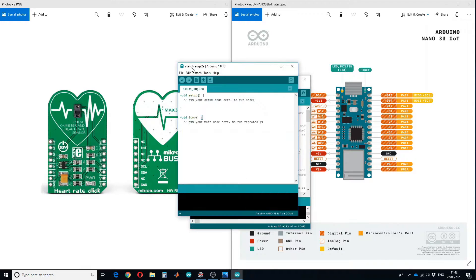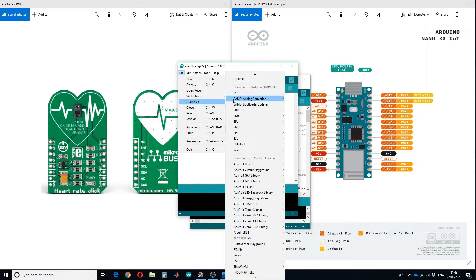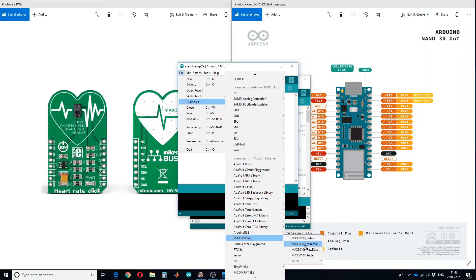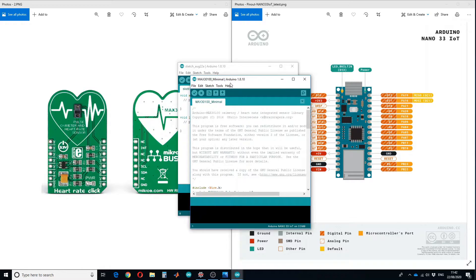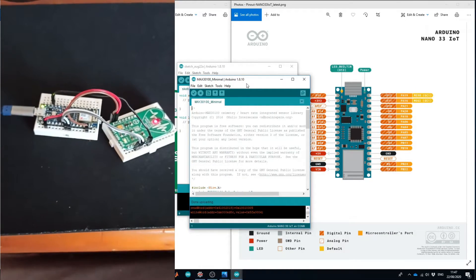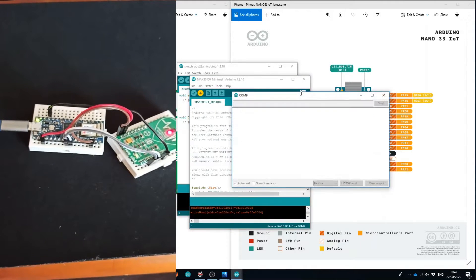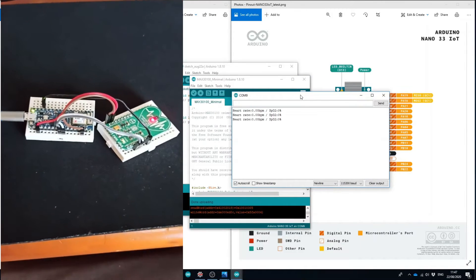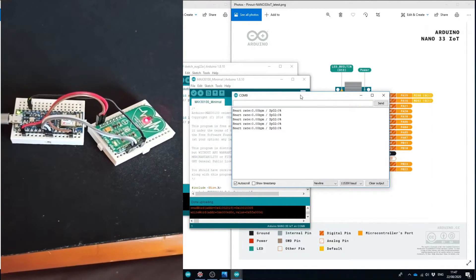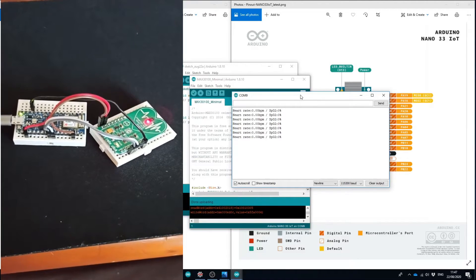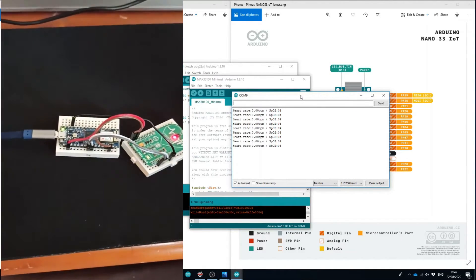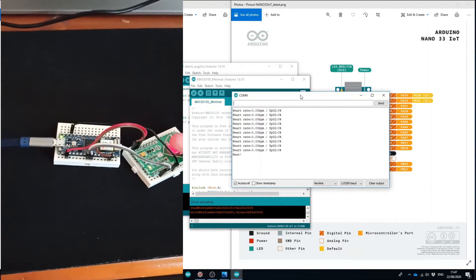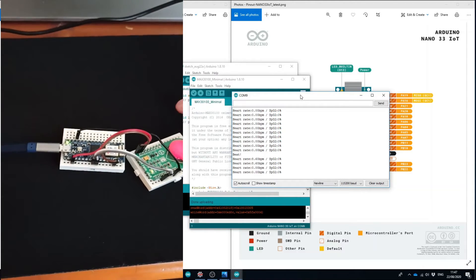Go back to Files and Examples, and this time open MAX30100 Minimal. This code will show you the heart rate and oxygen saturation after every heartbeat. Let's upload the code and open the serial monitor. Initially it will show zero heart rate because I haven't put my finger on the sensor, but if I put my finger on the sensor it will show my heart rate.